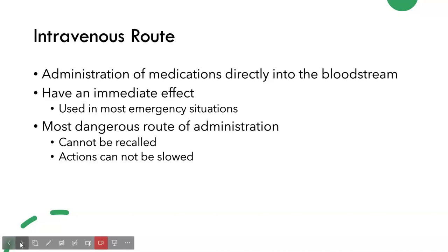There is also the risk of an air embolism. So we know embolism is usually a clot that travels throughout the body, can cause a stroke, can cause pulmonary embolism. So this is just in the form of air. So we have to be very careful to not introduce air into the bloodstream to cause any adverse effects associated with an air embolism.